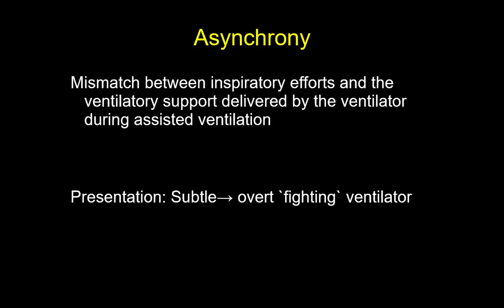Asynchrony. Now this is something I just want to touch upon, because there is not too much in it. It's a mismatch between inspiratory efforts and the ventilator support delivered by the ventilator. The ventilation is based on presumptions that this much should be the inspiratory time, this is when the patient should exhale, this is the amount of pressure the patient requires, this is the amount of flow the patient requires. It's based on your clinical judgment of the patient. That's how you select the modes. But it's not always what the patient requires, so they can be asynchronous. It can be subtle to overt fighting the ventilator.